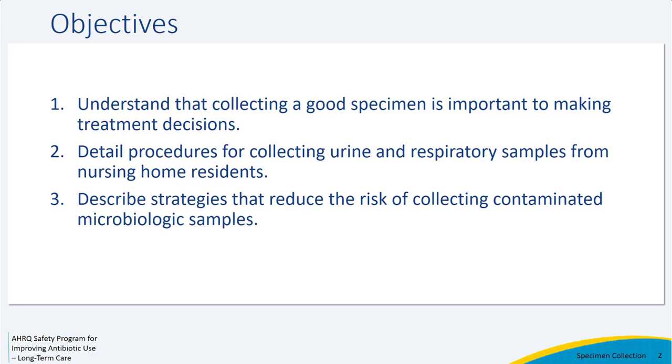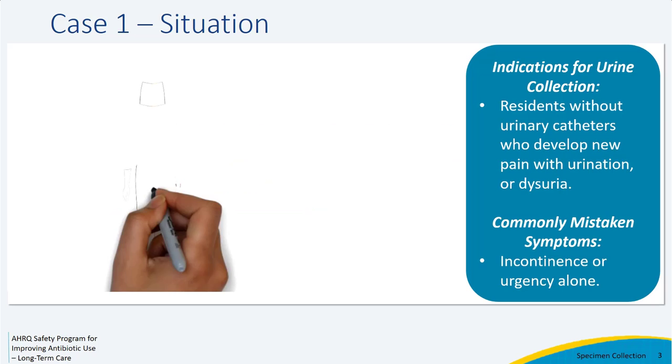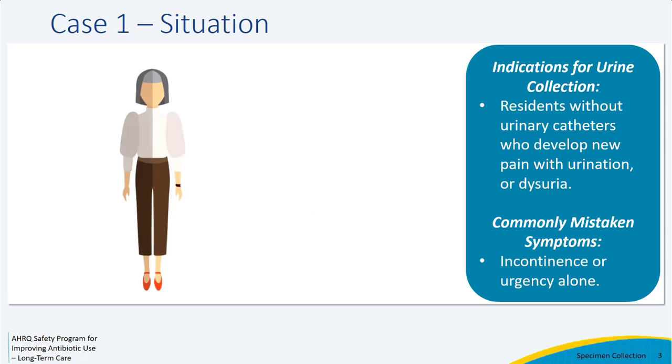The overall goal of this presentation is to help you collect high-quality samples, which will lead to better decisions about antibiotic prescriptions for your residents. Let's start by looking at a case.